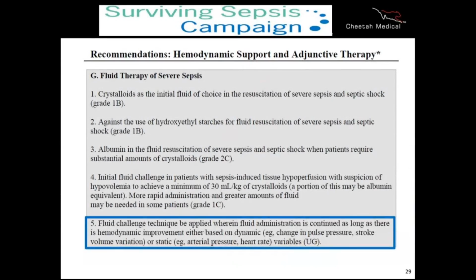The Surviving Sepsis Campaign actually says that you can use either static or dynamic values to guide fluid resuscitation as long as there's hemodynamic improvement.